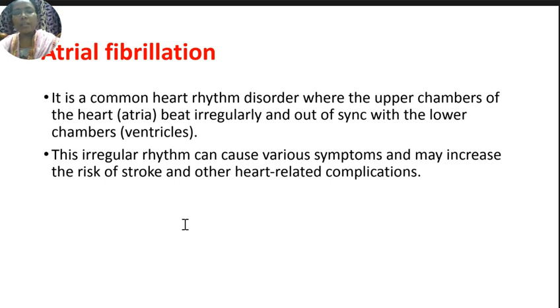In the ST segment there are two possibilities of abnormality: one is myocardial infarction and the other is myocardial ischemia. That is, the insufficient supply of oxygen and the heart attack. This is related to the ST segment and the abnormal T wave. If an inverted T wave, or a tall or peaked T wave occurs, it is due to previous heart damage or ischemia. The possibilities of a taller and a shorter T wave also represent abnormalities in the ECG waveforms.